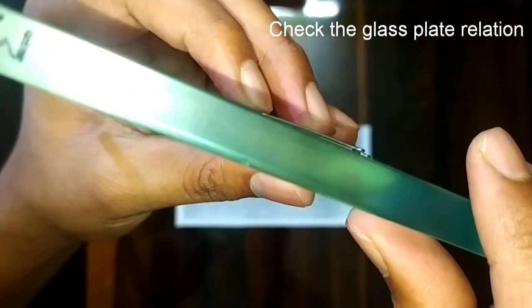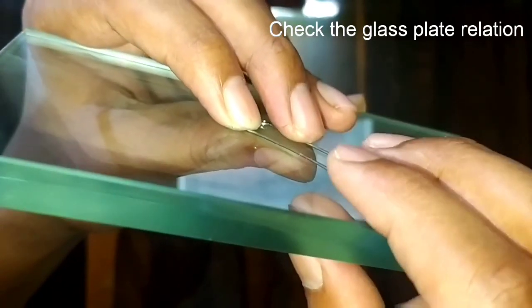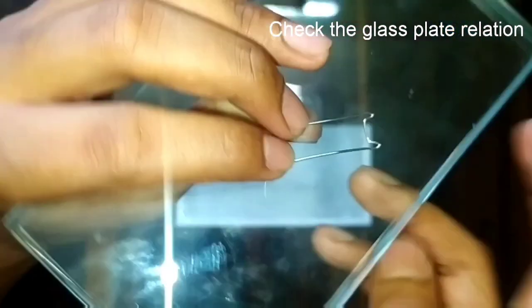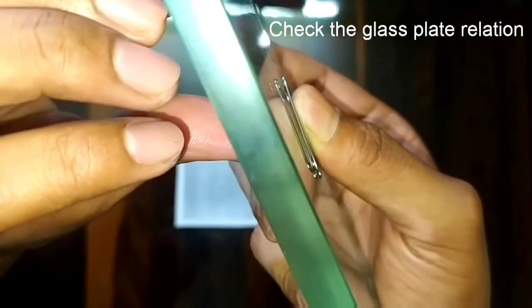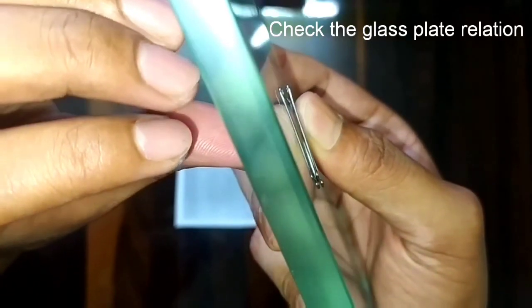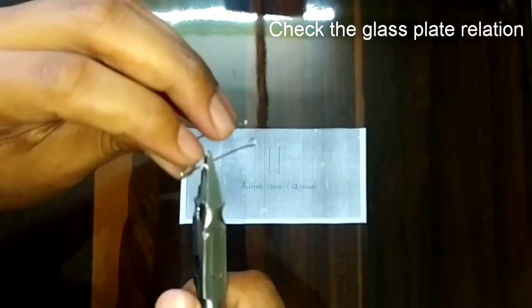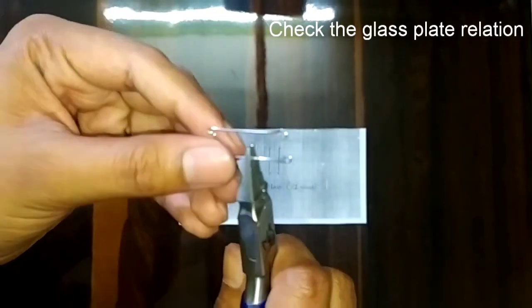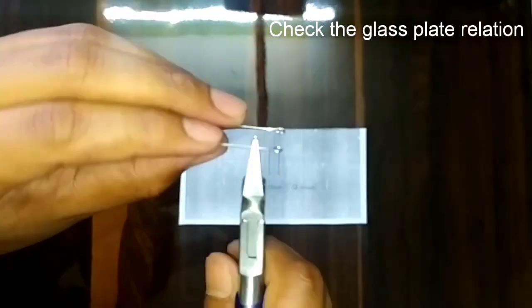Using the plier, we will make it straight. Here we can see that the Adams clasp is ready, that is its outline form.